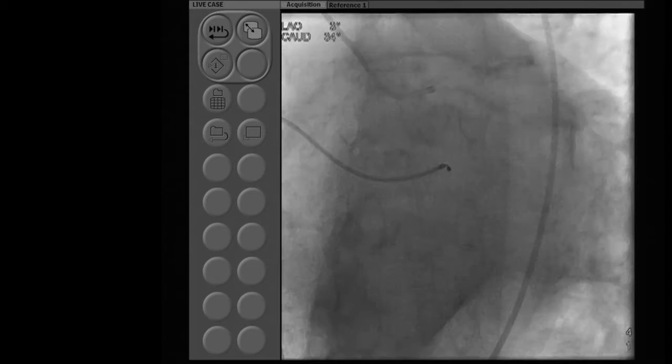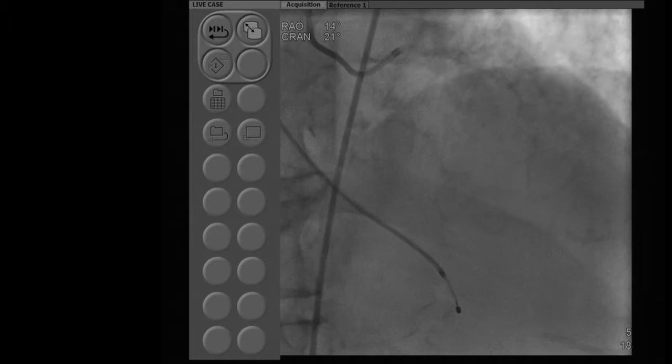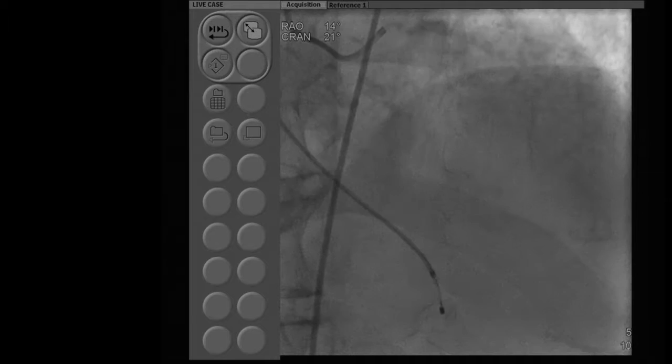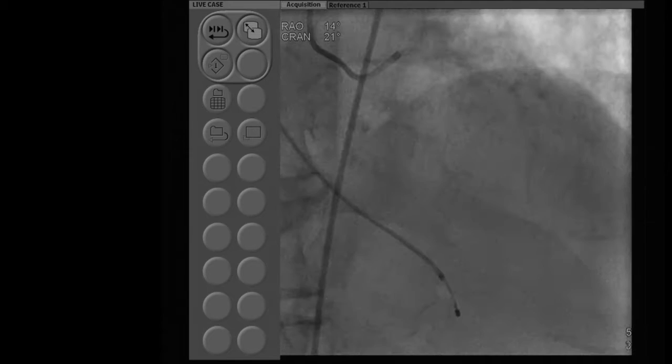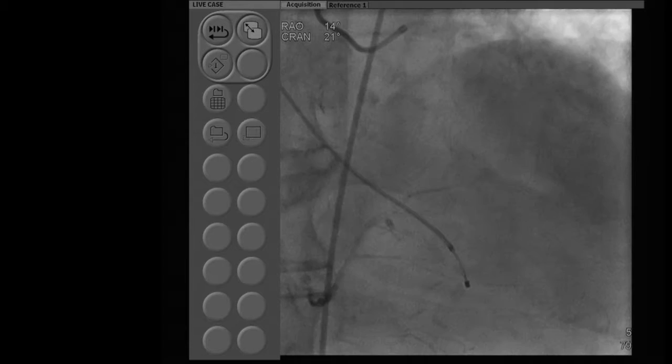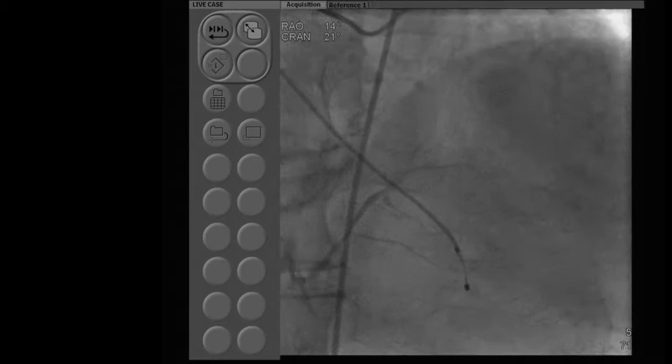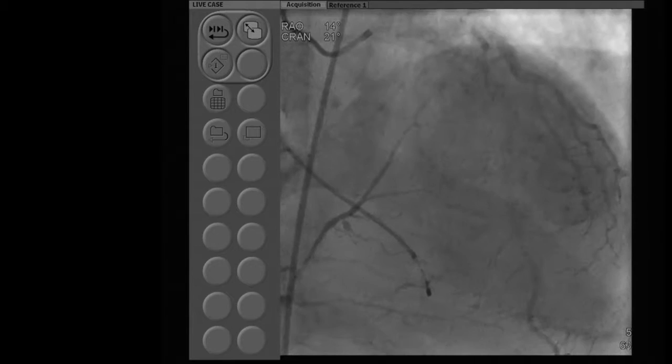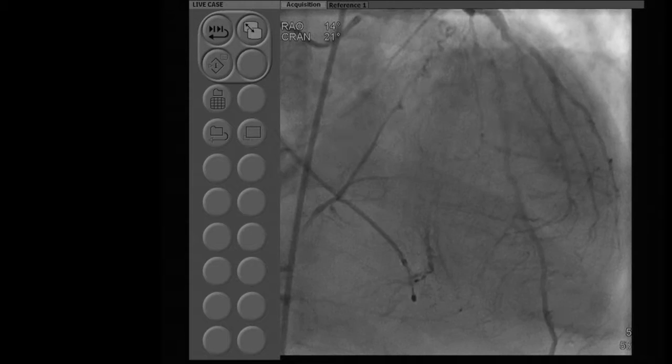On the cranial view, there is calcified LAD — mid LAD 70-80% — and you can confirm the distal left main disease. The RCA is totally occluded. This is also important: when patients come to you with valve disease, there are limited pictures you need to take just to define the coronary disease, especially in elderly patients who always have some degree of CKD. The creatinine is 1.4 — borderline CKD for his age.